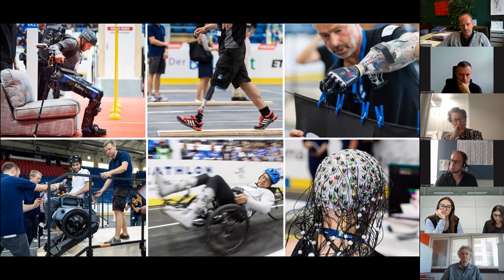And the pilots were invited to come with their software and with their hardware and with their pilot, which could be trained to use any kind of commands and any kinds of thinkings to drive her or his avatar in a game. There were three separate commands possible to deliver to our game in order to perform a racetrack successfully and win a race against the three other competitors.